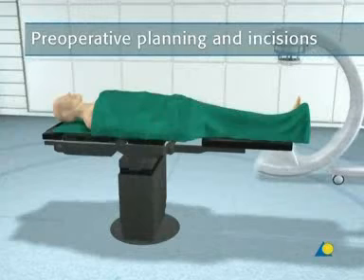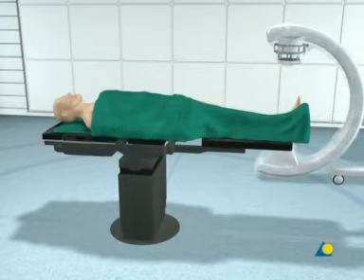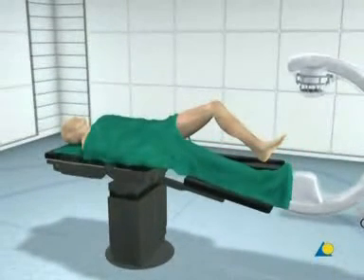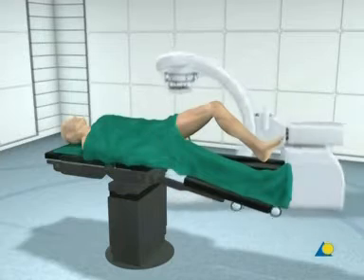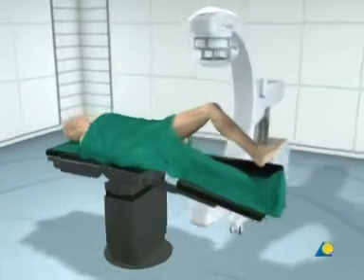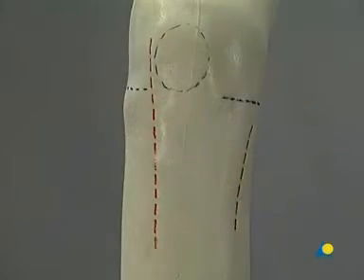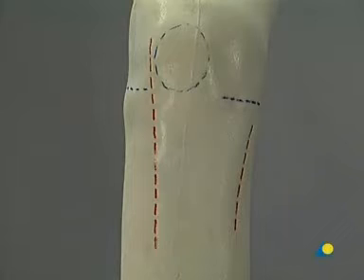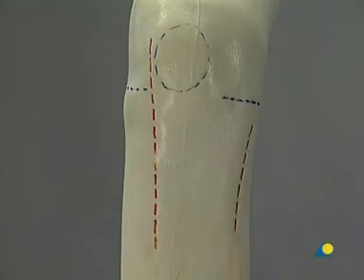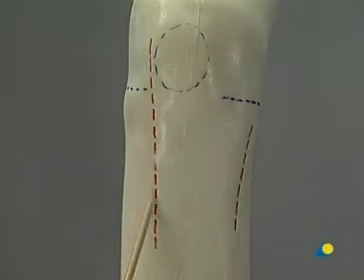Preoperative Planning and Incisions. The patient is positioned supine on the operating table with the injured knee flexed approximately 60 degrees. The uninjured leg is lowered so that C-arm images can be taken in both AP and lateral planes. To fix such complex injuries, two separate incisions are preferred — one posteromedially and one laterally — in order not to interfere with the delicate soft tissue cover over the tibial tuberosity.